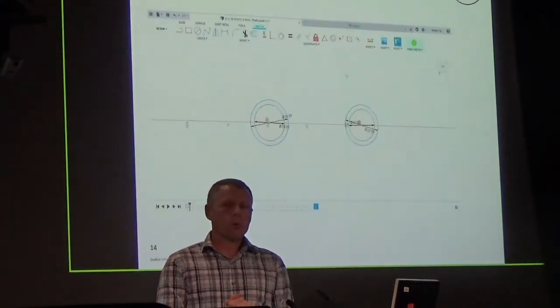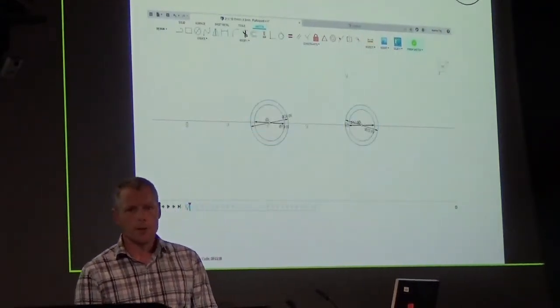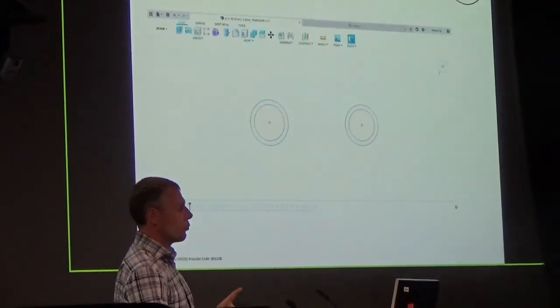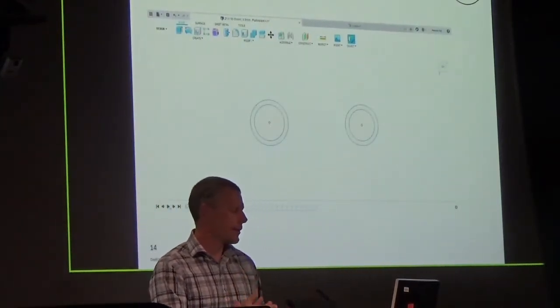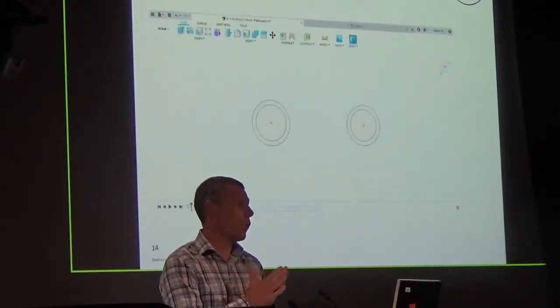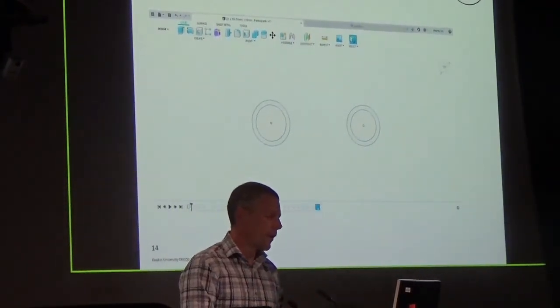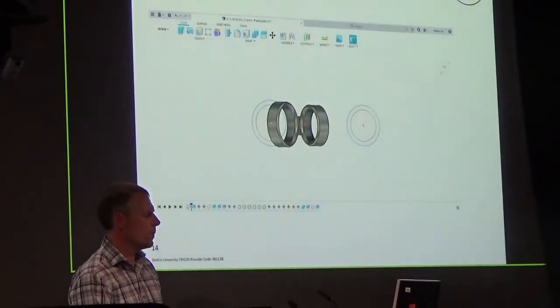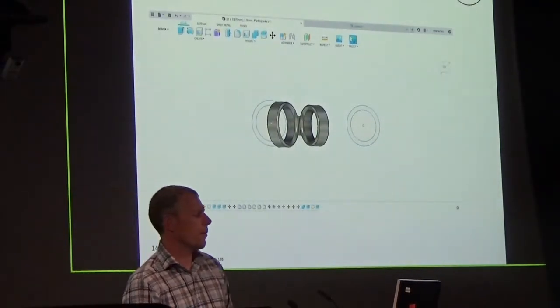Ideally this will all become an automated process, so that you simply measure the outer limit of the finger, a circumferential measure, or a diameter radius, and you type those numbers in and it all automates through. So that aspect that it's just played through just shows in a second that I've modified the splint.